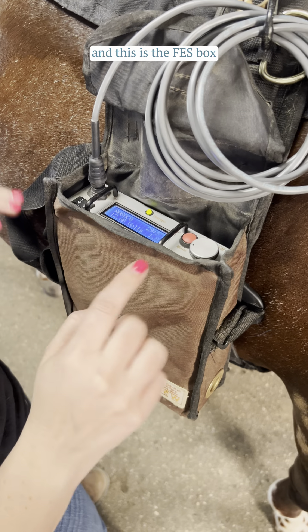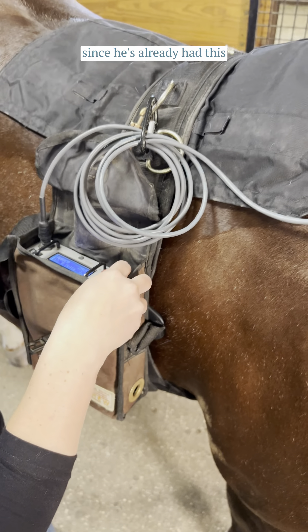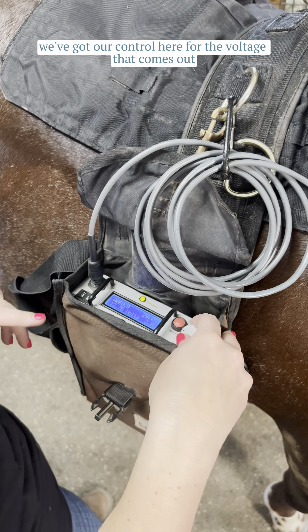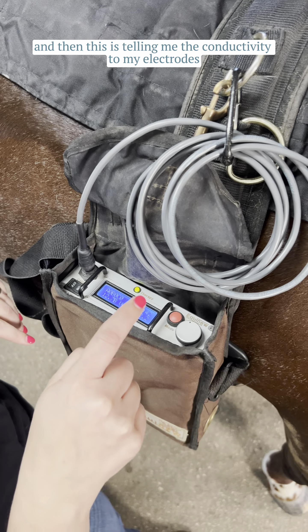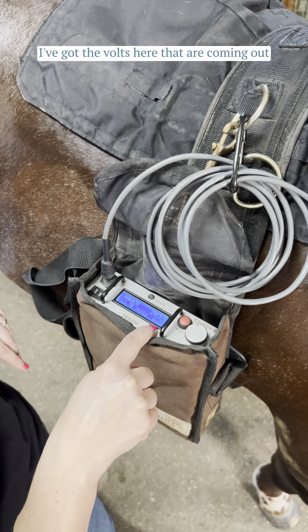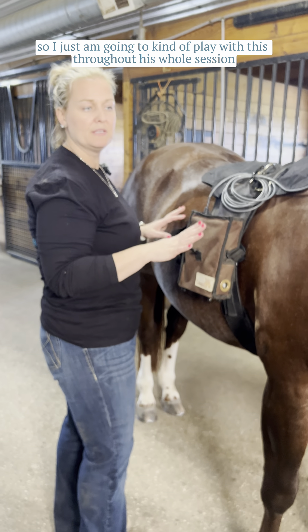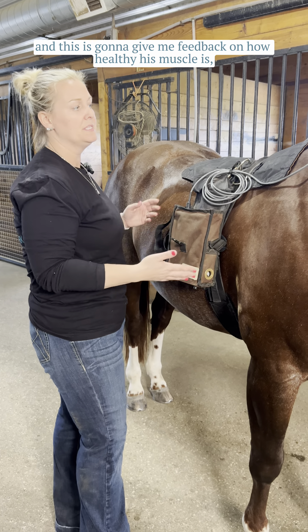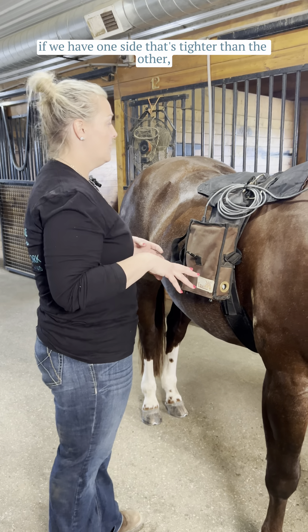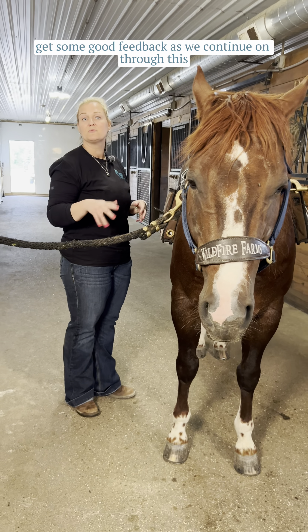So this is the FES box — this is how I control the electrodes. Since he's already had this, I can go through it a little faster. We've got our control here for the voltage that comes out, and this is telling me the conductivity to my electrodes. I've got the volts here, and the length of time remaining. I just play with this throughout his whole session, and it gives me feedback on how healthy his muscle is, if one side is tighter than the other, any spasms we have going on — those sorts of things.